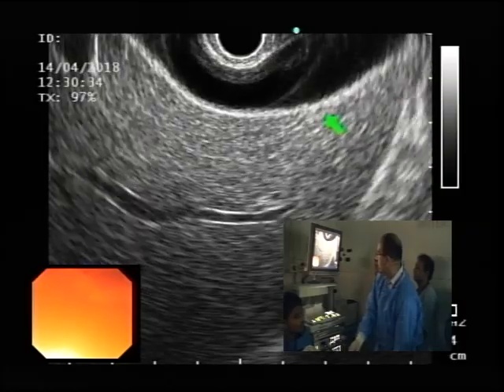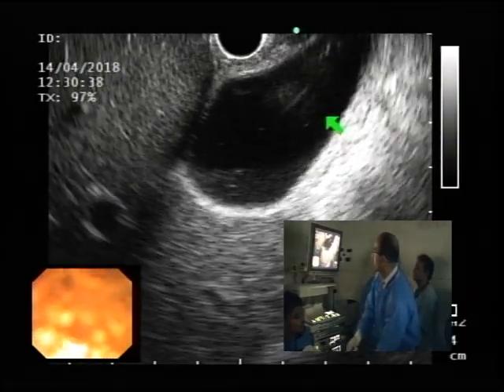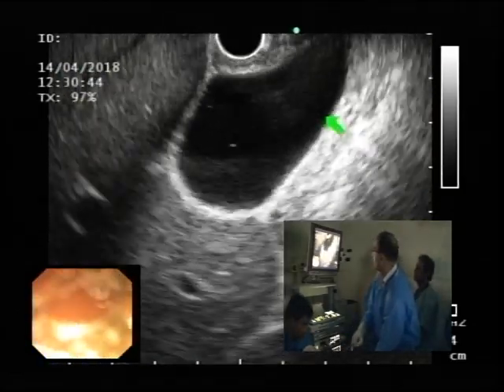And that you have to really, that's what you are doing. That's what you have to do. Make your wheels really go extreme to the counterclockwise. Exactly. My hand is turned all the way like this, and facing towards the floor, actually.